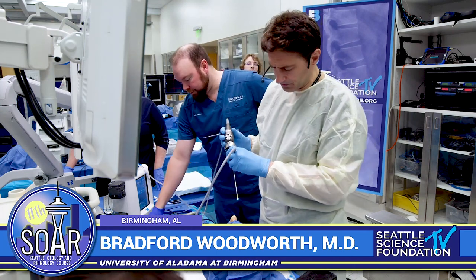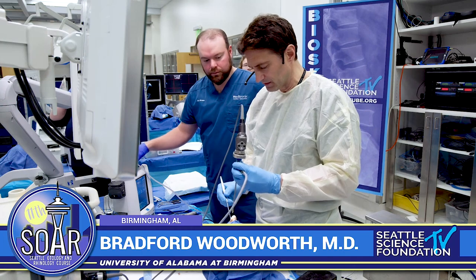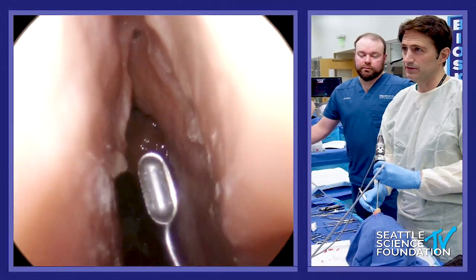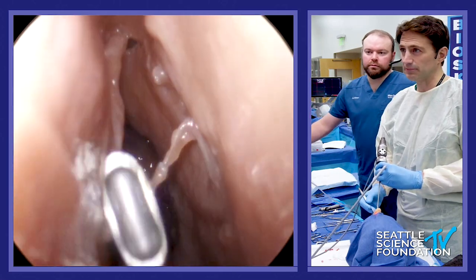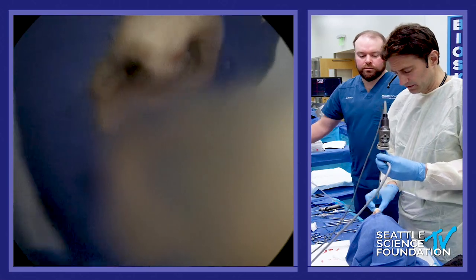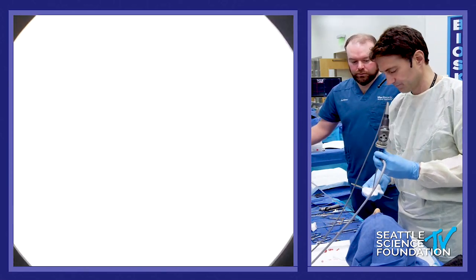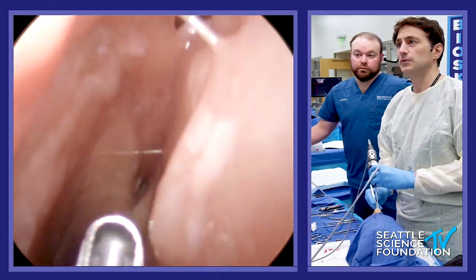So I pre-dissected my flaps. I do laterally based flaps, basically to take advantage of covering the exposed bone at the end. It may not look like I've done anything, but actually these are the flaps right here — one on this side and one up here.